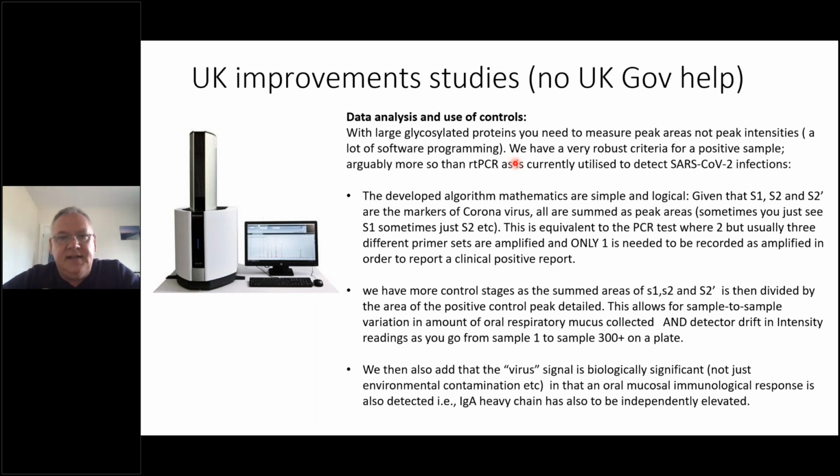And we actually had that, similar to something that Alex was showing. If we look slightly lower in the spectra, around about 10 to 11,000 Daltons, you pick up proteins which are associated with mucus. These are the mucus-associated proteins. They are heavily cross-linked with disulfide bonds, and they hold the mucus together.